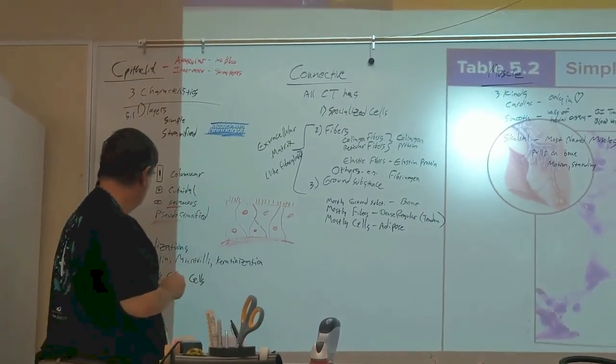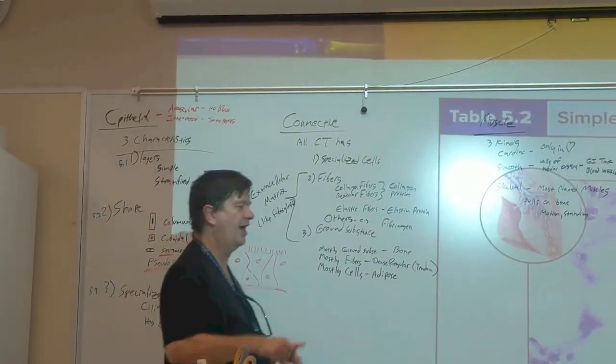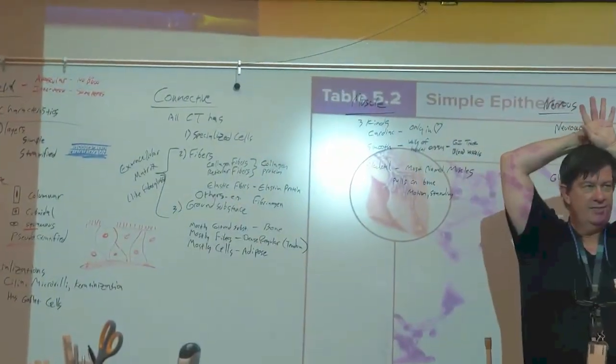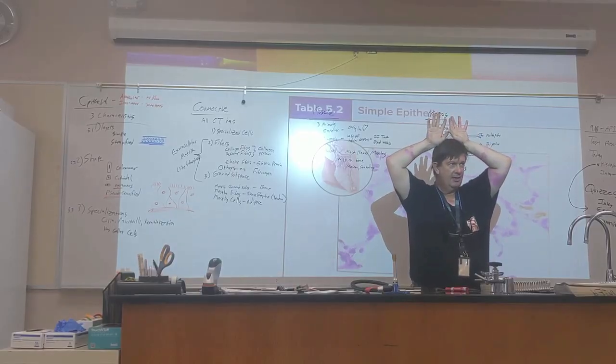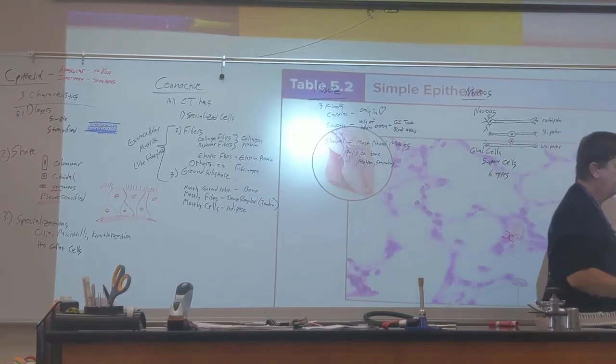All right. So you could have cilia. You could also have cells that have a thing on top we call microvilli. You saw some pictures before. They had up, down, up, down, up, down, up, down, instead of a flat membrane. Their membrane had lots of stuff on the top. That's to give extra surface area to absorb stuff. An example of that would be like kidney stuff.